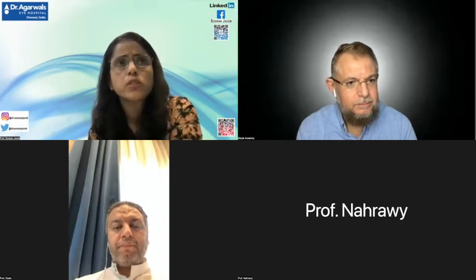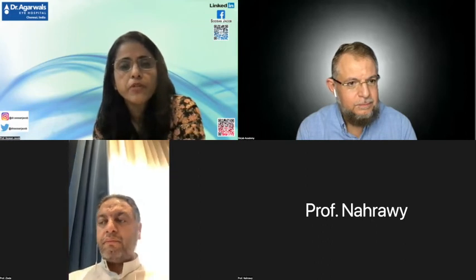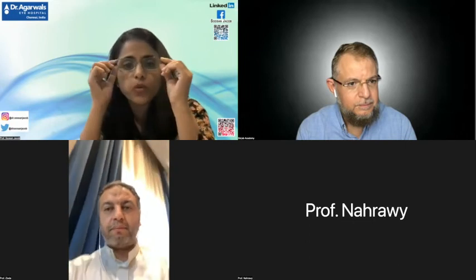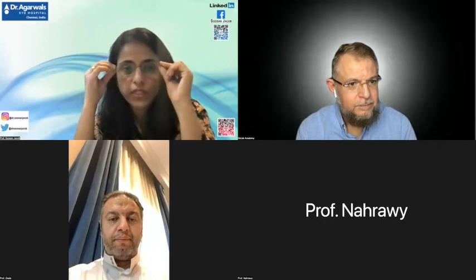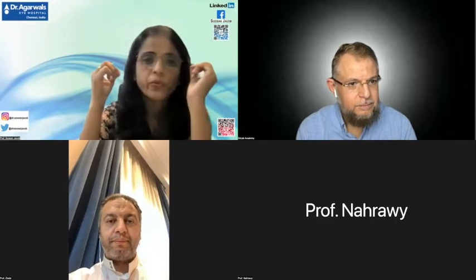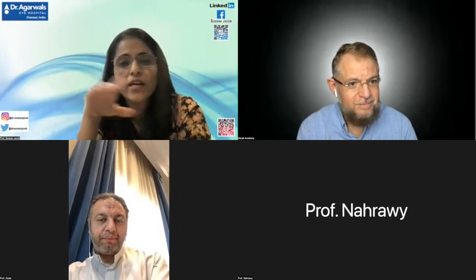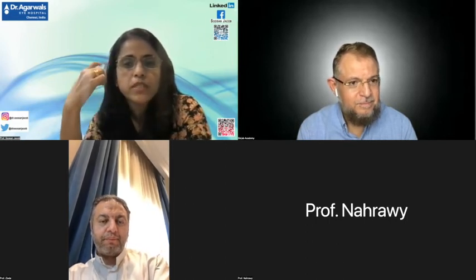Yes, absolutely. You're absolutely right, Professor Sanjab. This is actually a big advantage. Again, we've done a series of about 10 to 12 children where we've implanted. Our youngest was 8 years. They're able to cooperate reasonably well for the femtosecond laser channel. One very simple test that I do in the OPD is you just go to the child and touch the bare conjunctiva with your finger, and the child who doesn't flinch back or isn't nervous about it, generally they're able to cooperate under local anesthesia or under topical anesthesia. But if you do see the child being a little scared, you can ask your anesthetist to be there anyway and give a little amount of sedation, and you're able to make the channel easily.